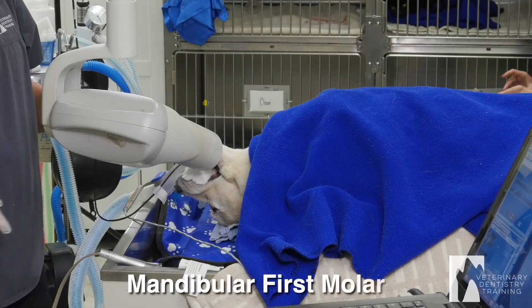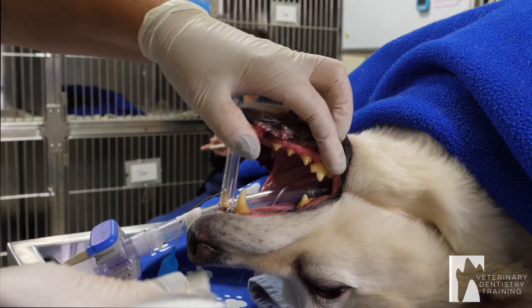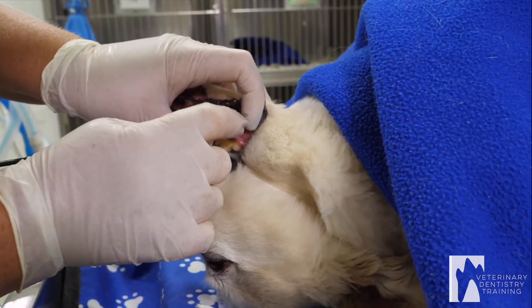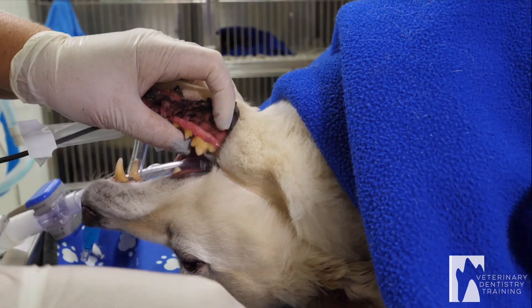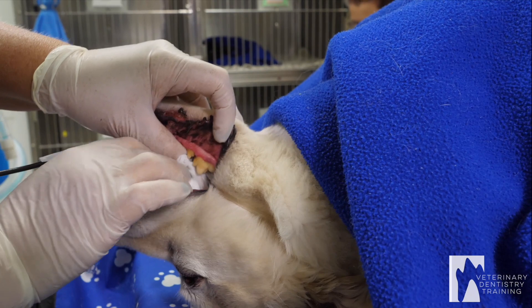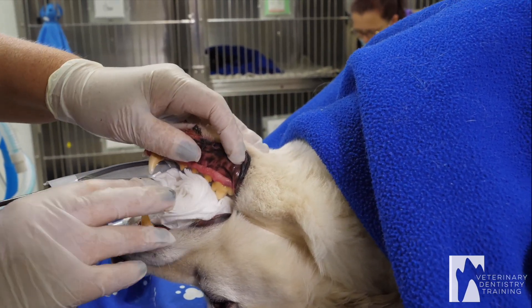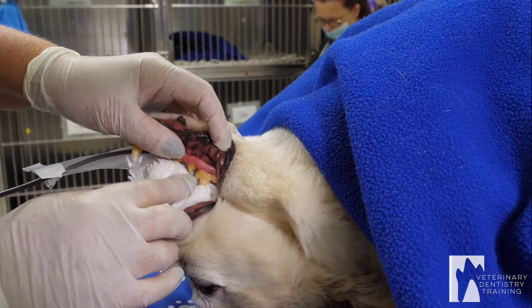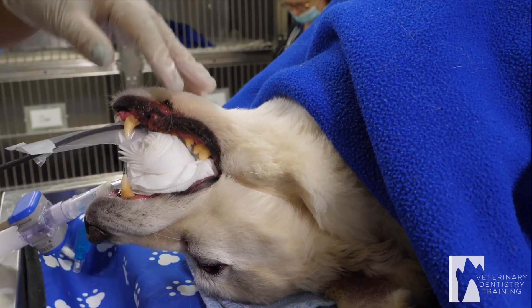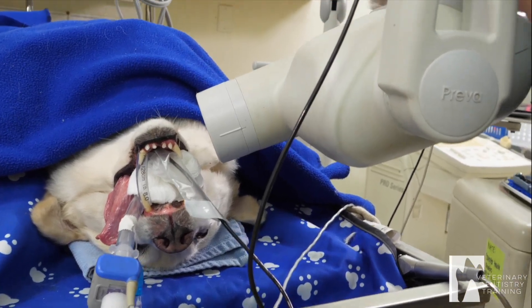Now I'm going to do the molar. I'm going to put a mouth gag in while I set this shot. I use a cut endotracheal tube as a mouth gag just so I don't get bit — sometimes they wake up. So I'm just doing this one tooth. Put the sensor parallel to the root, then take that wad of gauze and put it between the edge of the sensor and the upper jaw. The sensor is parallel to that root. I'm going to center my beam right there, and it's parallel to the jaw. X-ray.